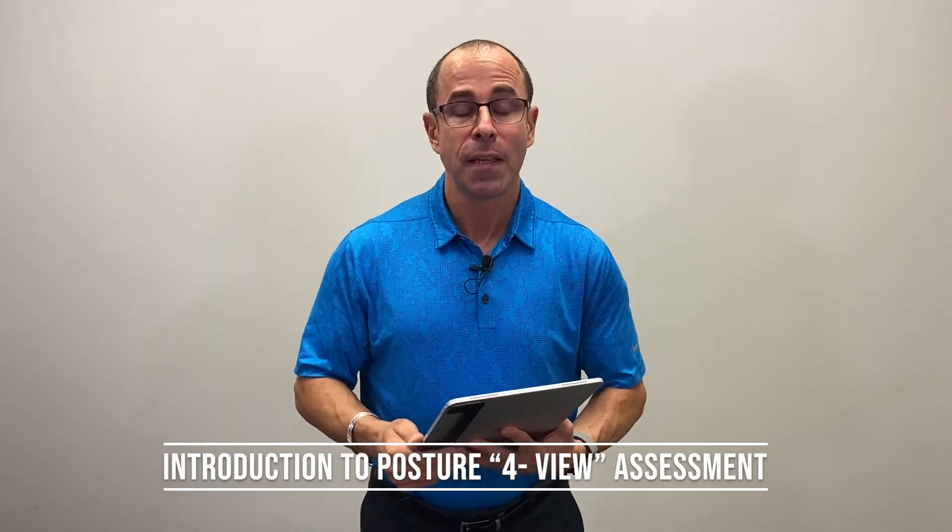Hey everyone, Dr. Joe Ferrantelli back here with Posture Screen, the posture analysis tutorial. This time we're going to go through a clinical view, a foreview.